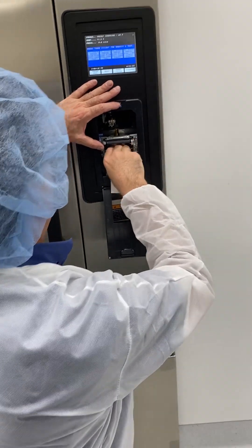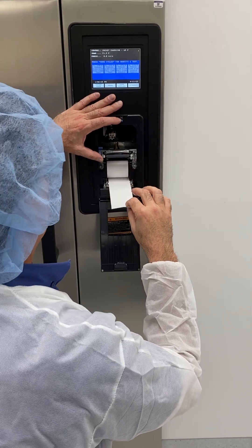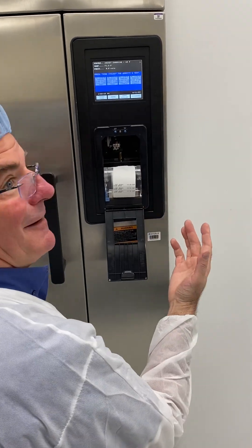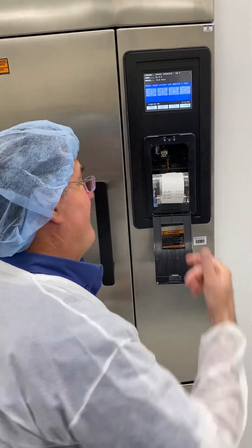I'll go ahead and put a brand new roll of paper in there. I can pull it a little bit because there's no gears. The door just comes down and shuts like that — it doesn't get any easier than that one over there.